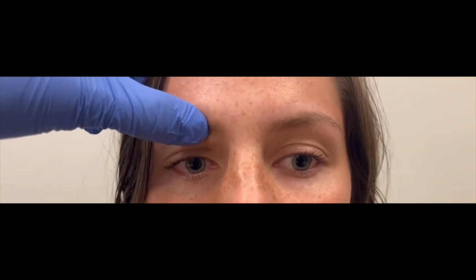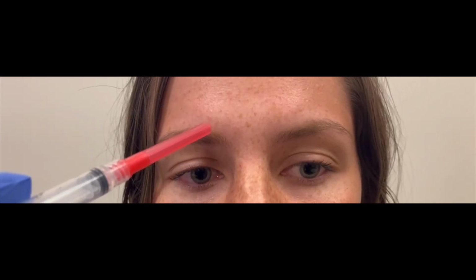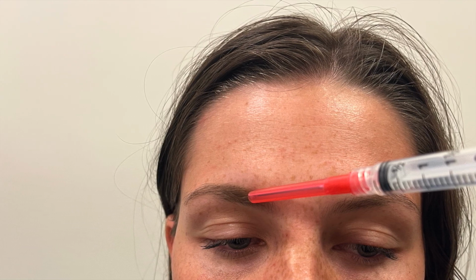Find the supraorbital foramen by palpating the eyebrow in line with the pupil when the patient is looking straight ahead. The notch you feel is the supraorbital foramen. Clean and then inject 1 to 3 mL of anesthetic just medial and superficial to this notch. This is the injection site of interest for the supraorbital nerve block.